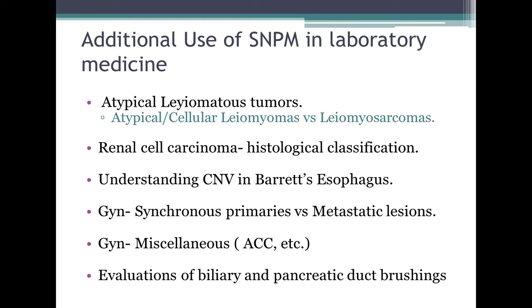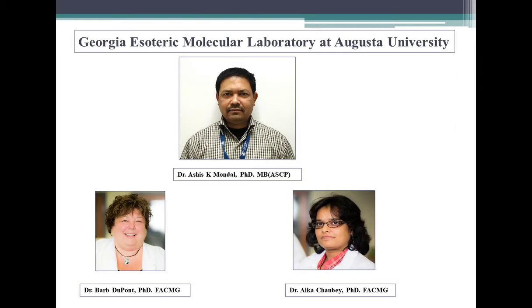We have an ongoing research project to understand the CNV in Barrett's esophagus, especially in cytology or smaller specimens. GYN oncology with synchronous primaries with metastatic lesions. As I earlier mentioned, we're also looking at evaluating this ability in biliary and pancreatic duct brushings.